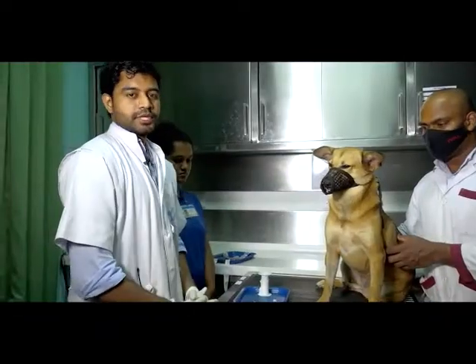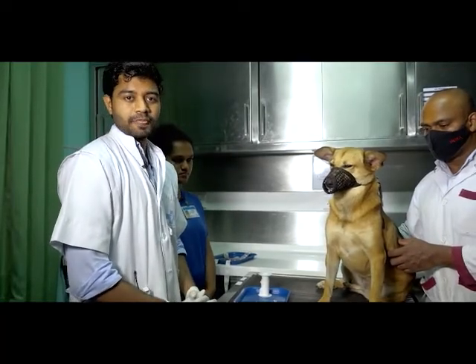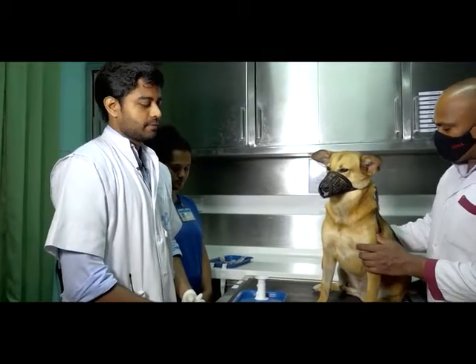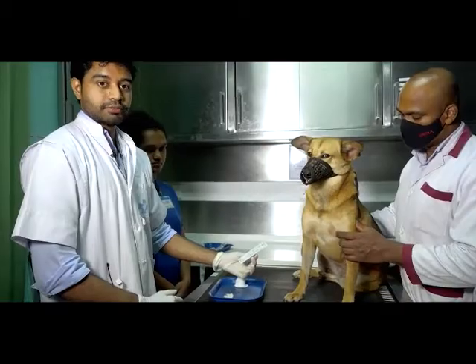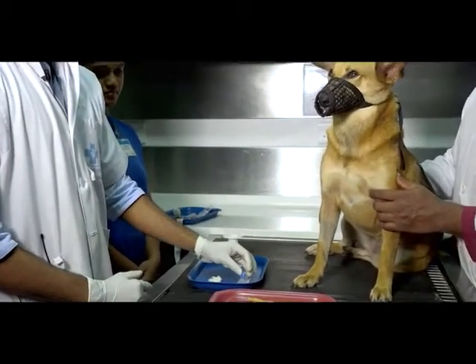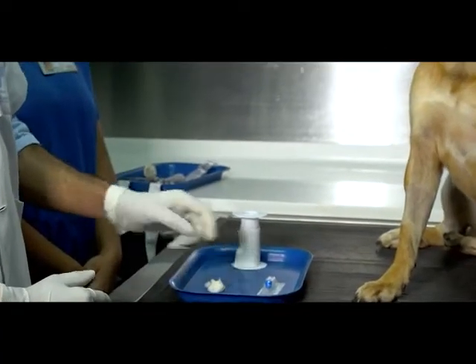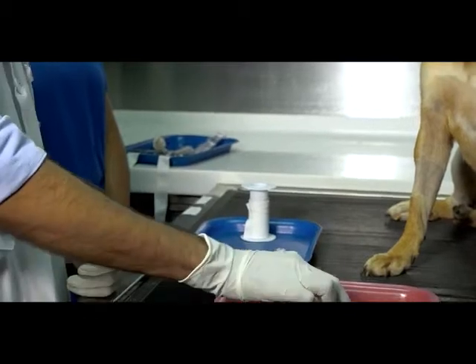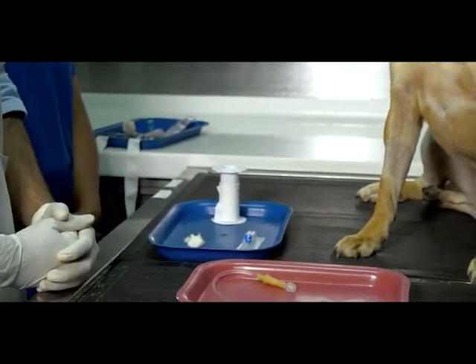So next we would be demonstrating to you how to place an IV catheter in a dog. Well, for that we would need an IV catheter of the appropriate gauge. Here we have a 22 gauge IV cannula, and also we have cotton that is soaked with surgical spirit or 70% alcohol, an infusion set, and also a normal saline connected to it.